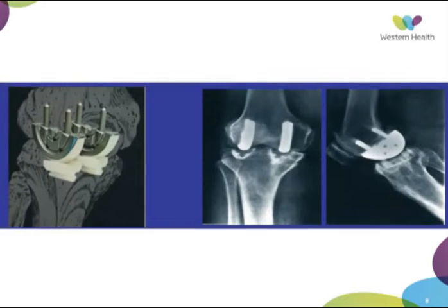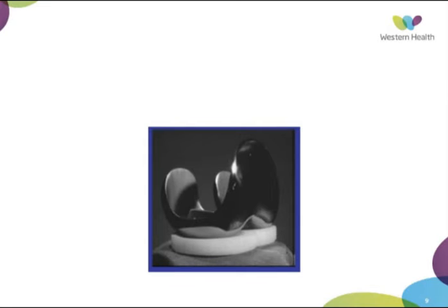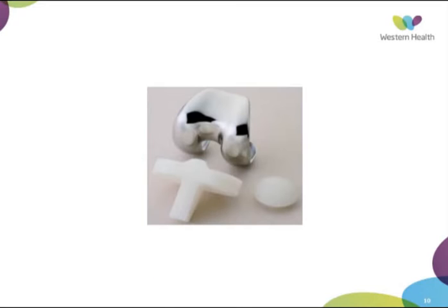And this is the evolution of condylar prostheses, initially with ones with separate prosthetic parts for the condyles. And then what we're more familiar with knee replacements looking like today, the condylar type total knee replacement. This is an example from the early 1970s from Japan. And this one actually had cutouts at the front and back of the tibial insert to allow for both the ACL and PCL to be preserved. And then Insall's condylar knee replacement, again from the 1970s, started to sacrifice the ACL.